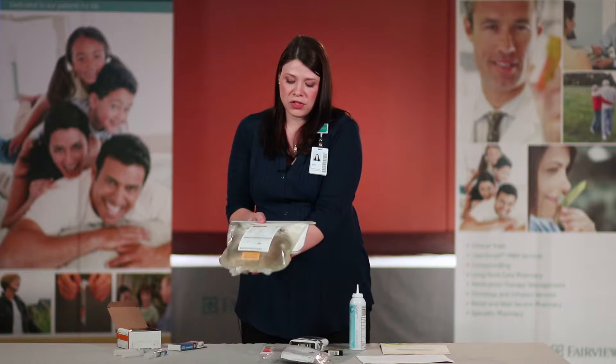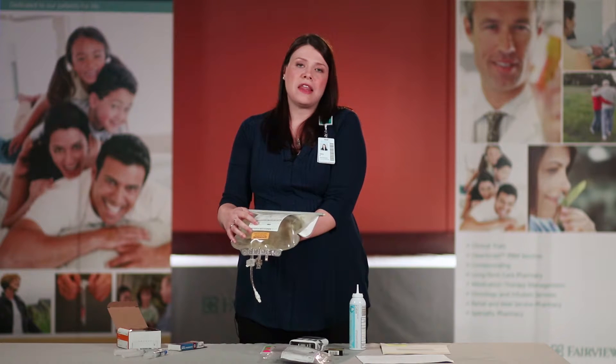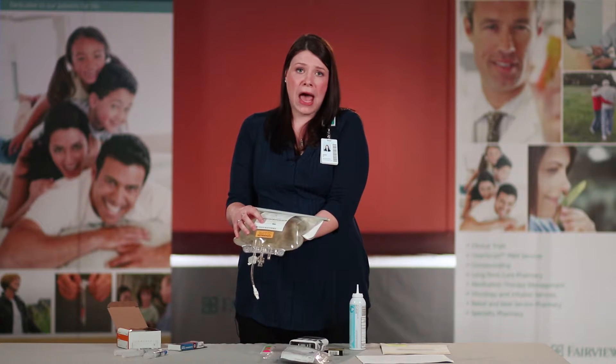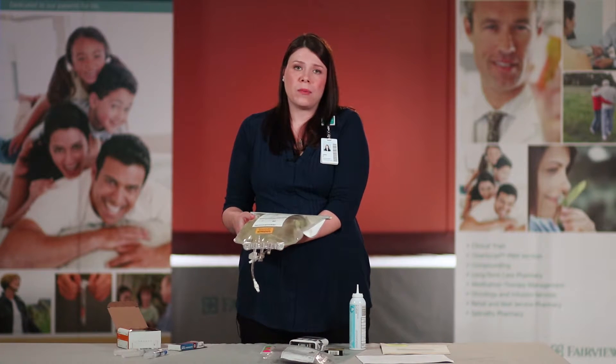First, you want to check and ensure that your TPN bag has your name, your date of birth, the correct medication, and there is a beyond-use date on your TPN bag — we want to ensure that that date has not passed. If any of the information is wrong on your label, you want to contact Fairview Home Infusion.